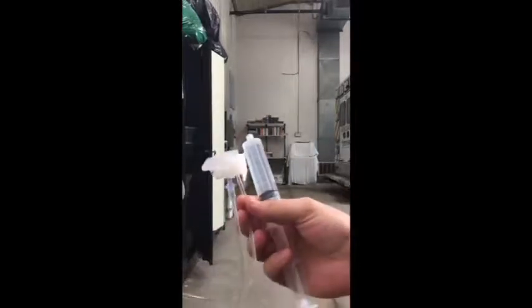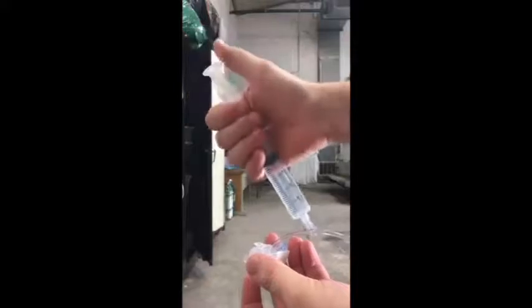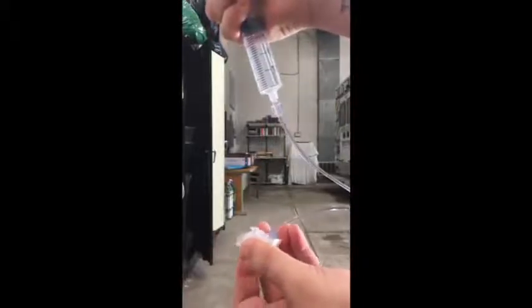It's a little bit trickier because once again, you have to have it upside down to fill it. And so I'll just attach our syringe, and you have to have it upside down, and you're the one feeding this. And so you're going to want to slowly push while massaging. Now you have to pull it back out before we can insert it.